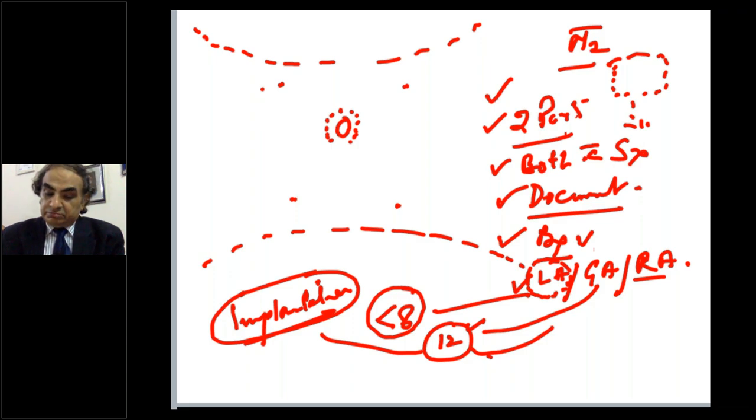The biopsy, which I was leaving here, yes, here biopsy, I should take it at the end. Some people are going in for a very known diagnosis. I'm not talking about gynecologists here, because they often have endometriosis to diagnose. When you do laparoscopy for some time, you can achieve petechial hemorrhages in the peritoneum, which look exactly like endometriosis, so you can be confused. So for endometriosis, you go in first, do the job, and come out. And usually it's all confined to the lower end. Well, I'm talking about surgery today, so I'll stick to that.